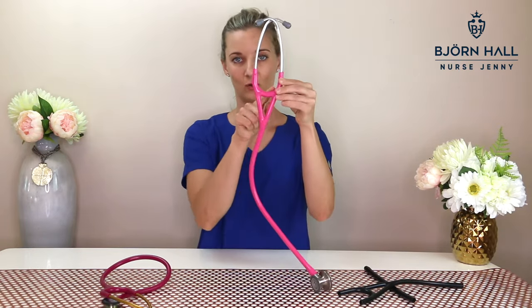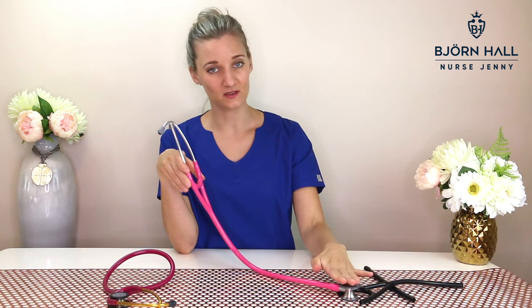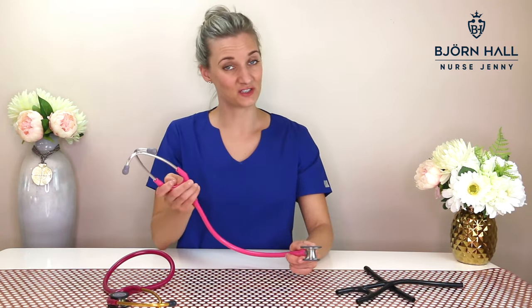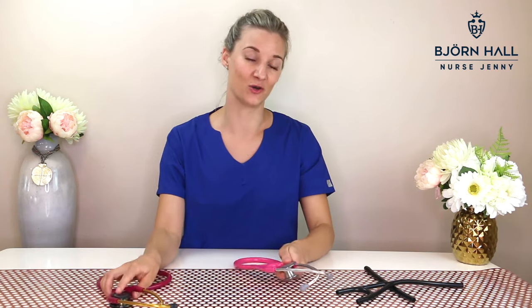Then we've got the look of it. This is what you call an A-frame, and the regular stethoscope is a Y-frame. The Cardiology 4 also has thicker and shorter tubing, and this is to minimize sound interference from traveling from the chest piece to the binaurals. As the name suggests, cardiology stethoscopes are designed to be used in the field of cardiovascular medicine. However, it can also be used for all other purposes, just like a regular stethoscope.